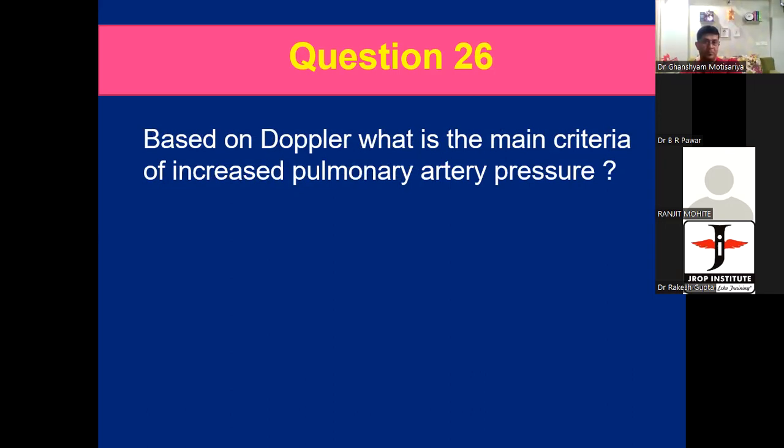Yes, sir. What is the main criteria for increased pulmonic artery pressure based on Doppler?